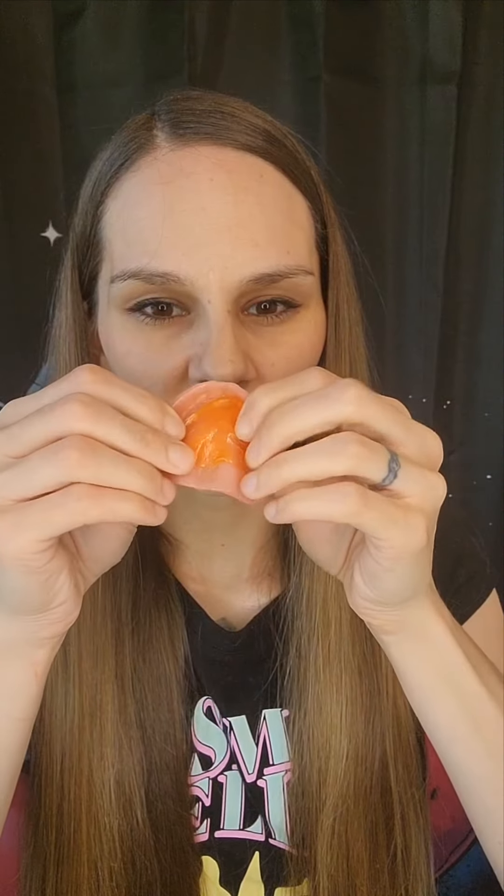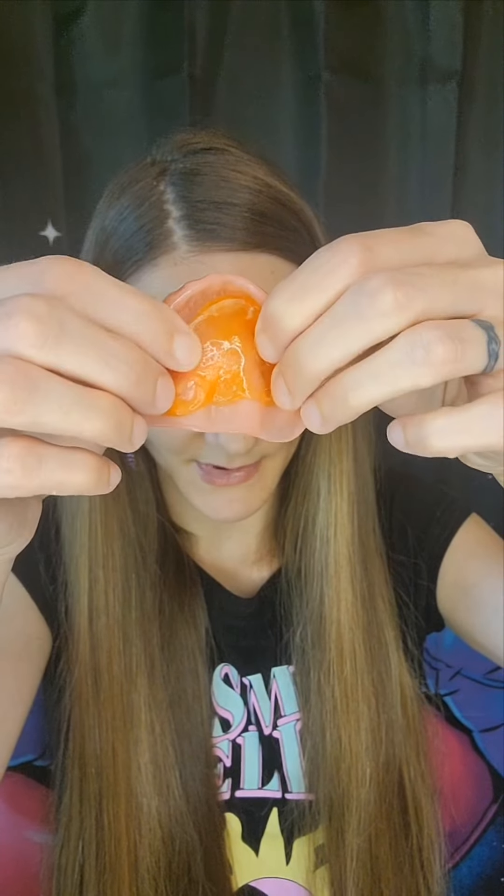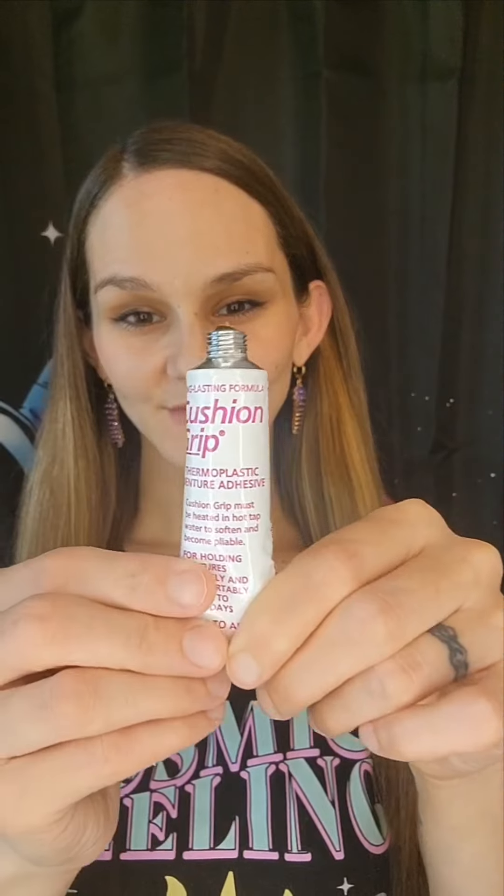Now, I'm going to take my top denture and I'm going to stick it to the very top and hold it with my finger while I press it down along the denture. And I'm not going to worry about going up on the sides just yet because I'm applying two layers of cushion grip in this video. So I am just going to get it down there first.